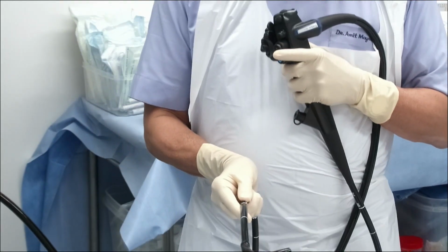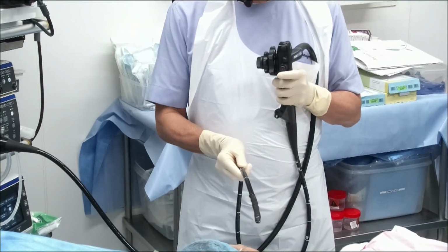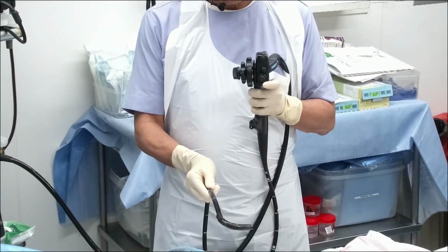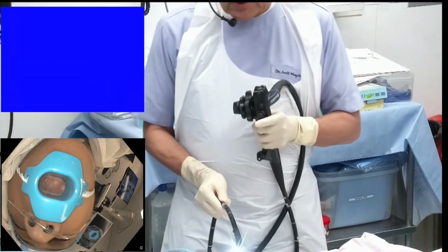So now if you see here, when I am moving the big wheel away, the scope is going towards the back of the patient. When I am moving the big wheel towards me, the scope is coming towards the anterior abdominal wall of the patient. So in this position now, I am going to start the actual procedure.